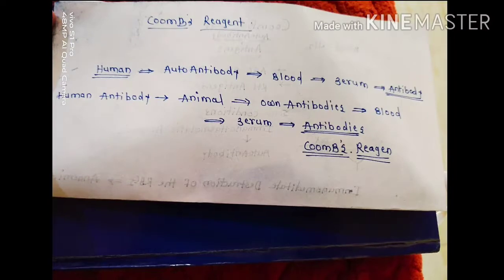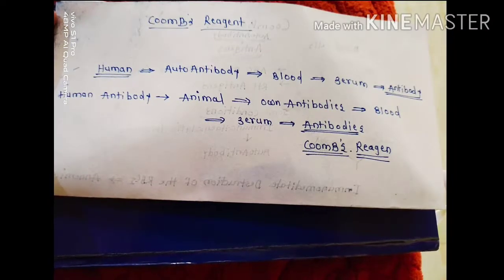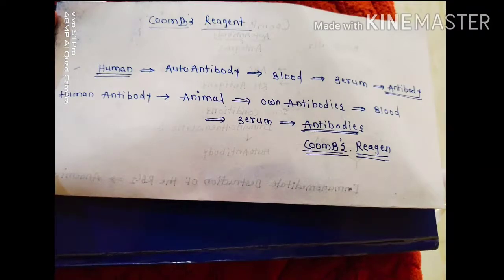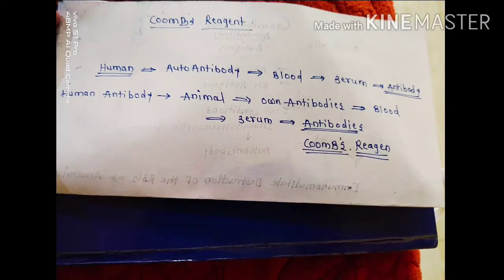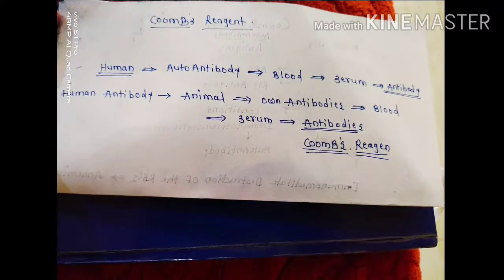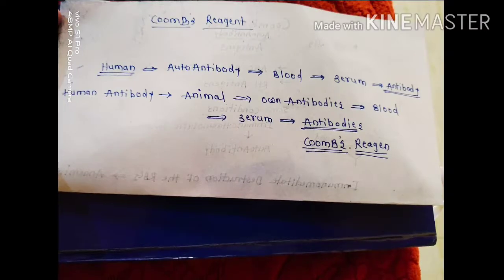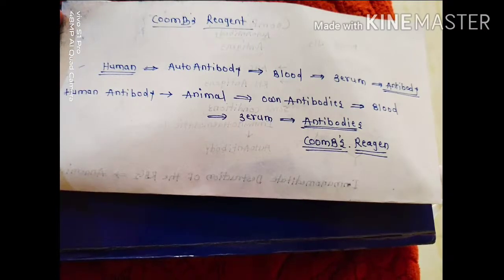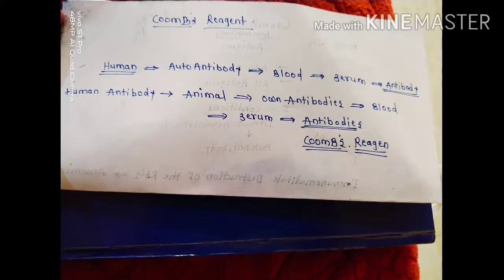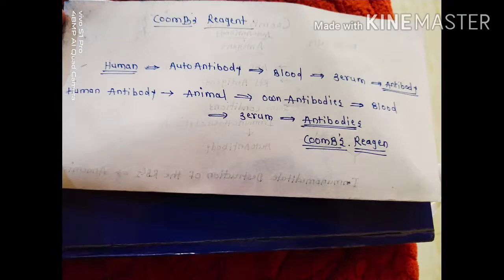In this way we form the Coombs reagent: we take blood from a human with autoantibodies, separate the serum, take the antibodies from it, and inject these antibodies into any type of animal. This animal produces its own antibodies against them, and we take these antibodies as the Coombs reagent.